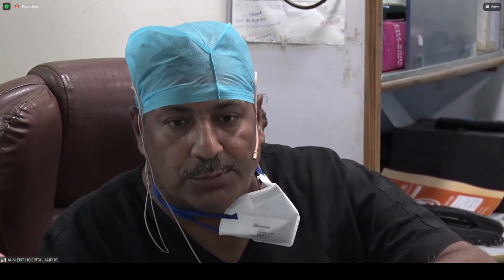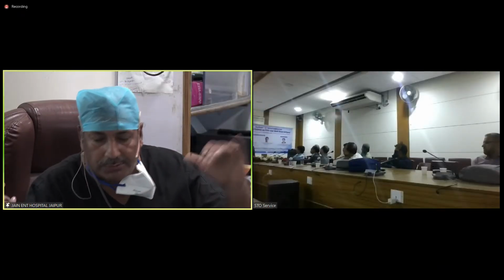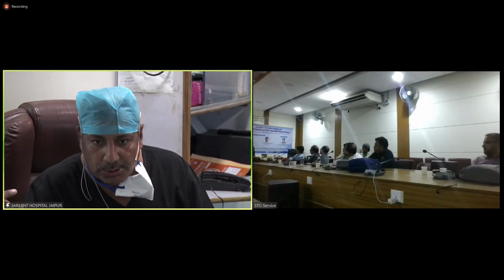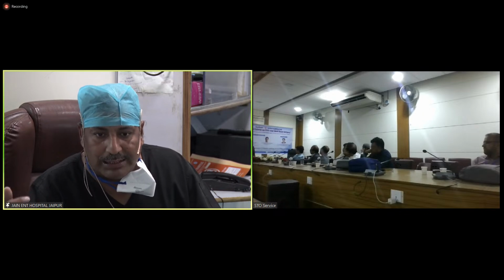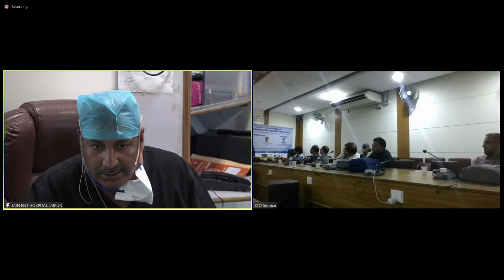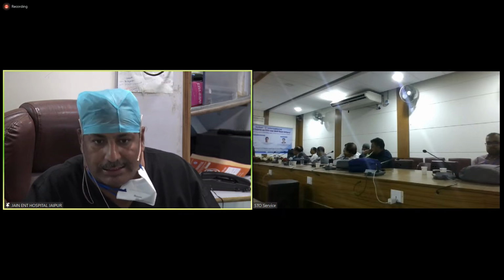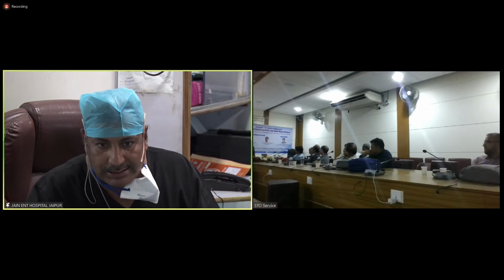Retract your eustachian tube by your assistant so you can see a more in-depth view of fossa of Rosenmuller without damaging the eustachian tube. You are not supposed to damage the eustachian tube cartilage. That is very, very important, with muscles attached over it, which are important to regulate the function. So the goal is not to damage anything, not to do anything forcefully, not to go anywhere beyond visualization. These are the important points. If you follow, you cannot damage anything.